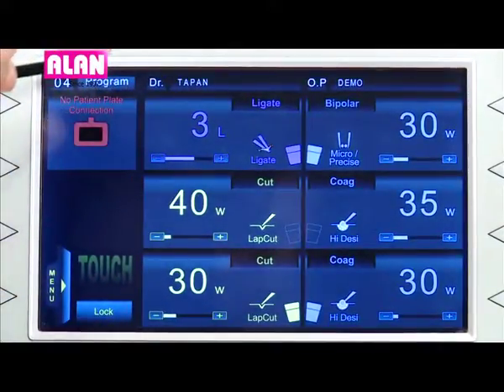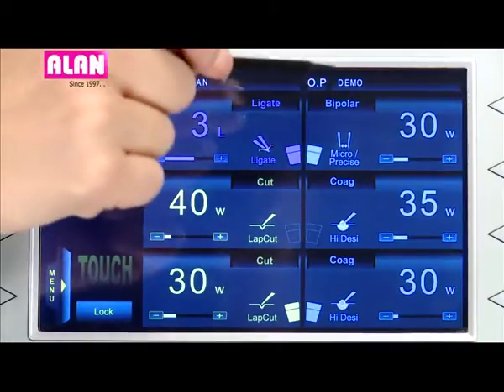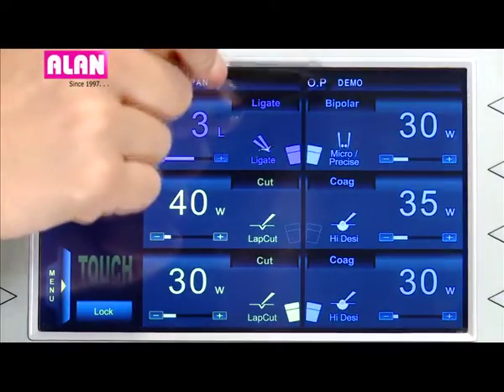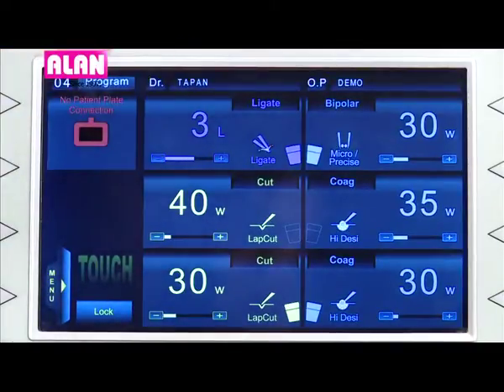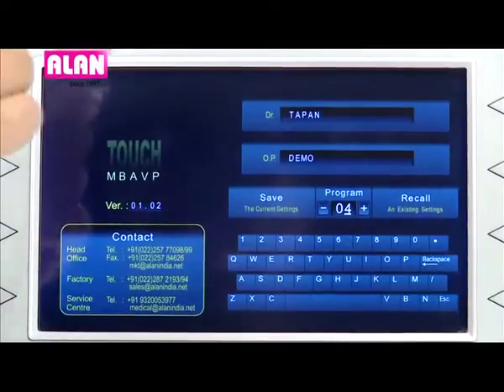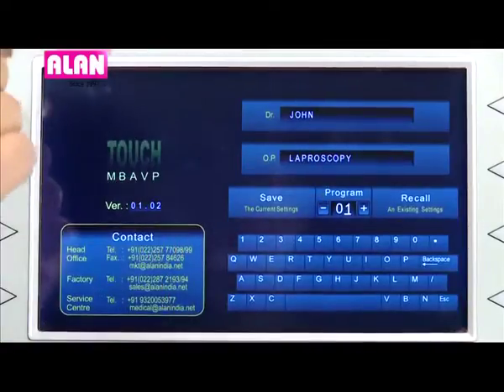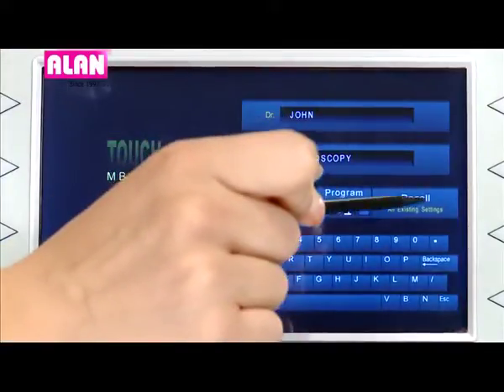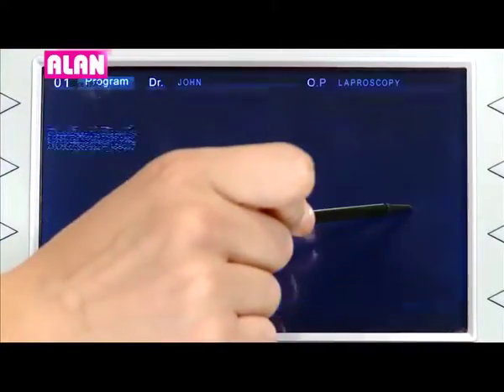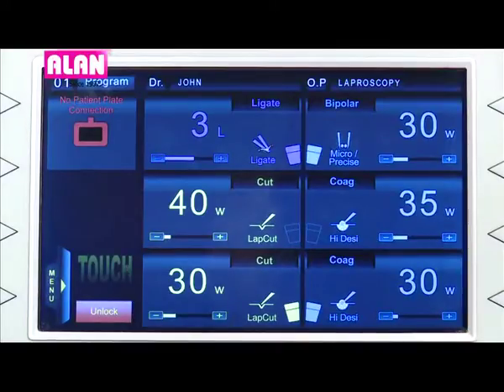To recall a saved program, touch the program icon, select the program number, and touch the recall icon. The selected user settings will be restored on the main screen.